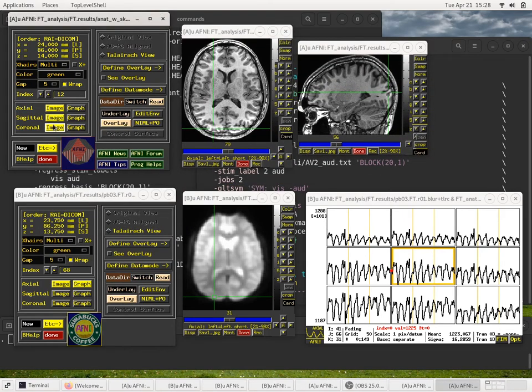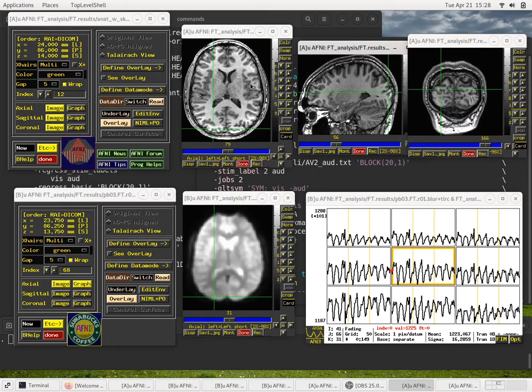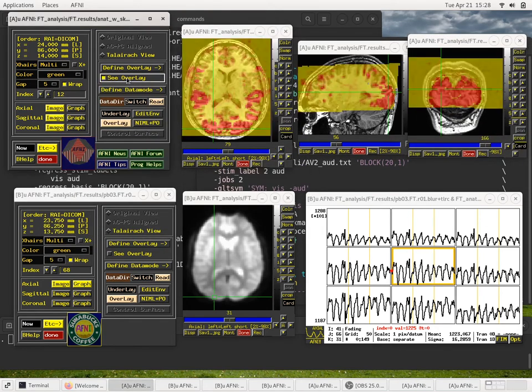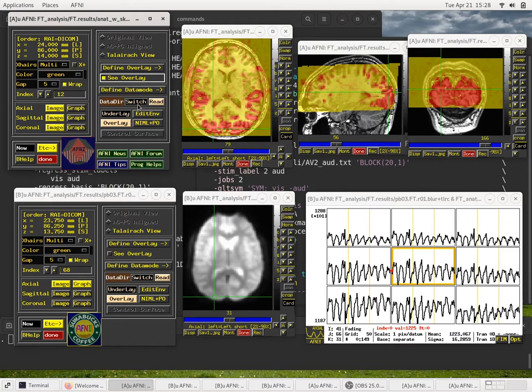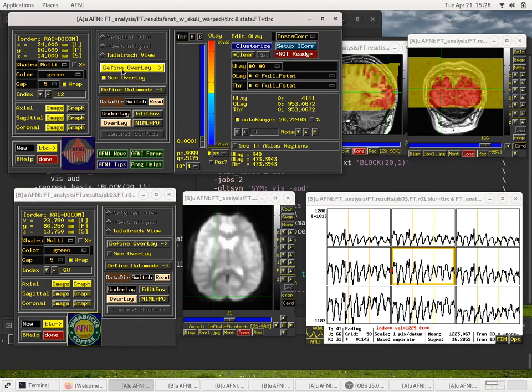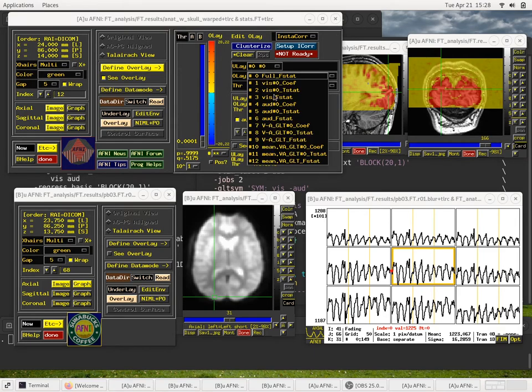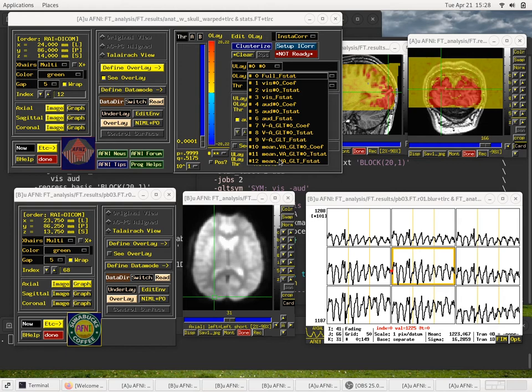Let's leave the blurred time series on the bottom for now. We'll actually change that in a moment because we want to see all three runs. We can use controller A and set the underlay perhaps to be like an anatomy. We'll set the overlay to be the stats output, so stats.ft.